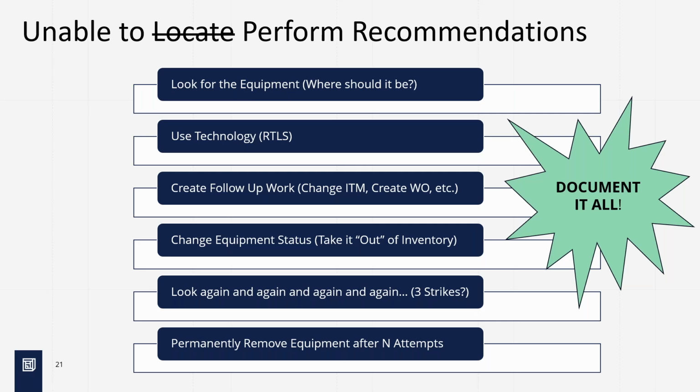Well, yeah. You send out what you can't find in their department. They look for it. The process is not just taking pieces of equipment out because you can't find it. It's days after you've done what, asking the user to help look for it, like you were saying, and document that too. Aligned with what you were recommending there?